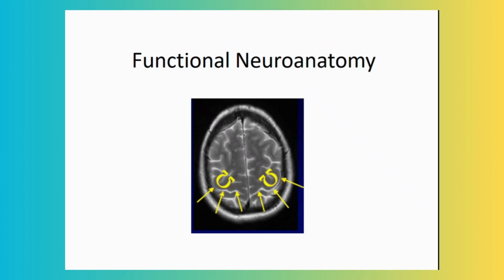The deepest sulcus, which goes almost to the interhemispheric fissure, is the central sulcus. You can see that this sulcus is almost touching the interhemispheric fissure. That is one identification. The other identification is the pars marginalis here. There are two contiguous sulci here; we call it the pars marginalis, and the sulcus next to it is the central sulcus. So this is the central sulcus.